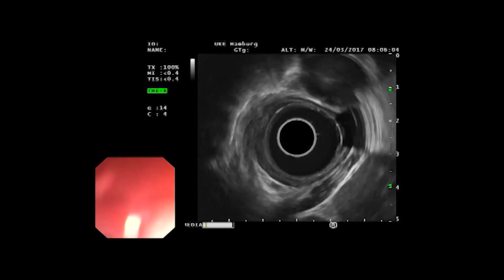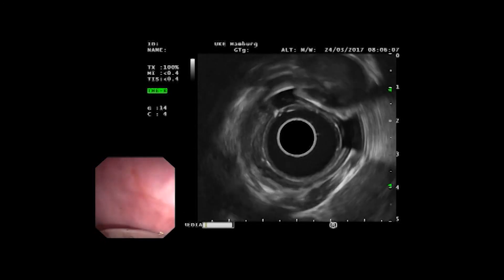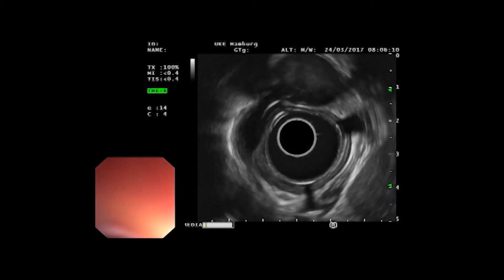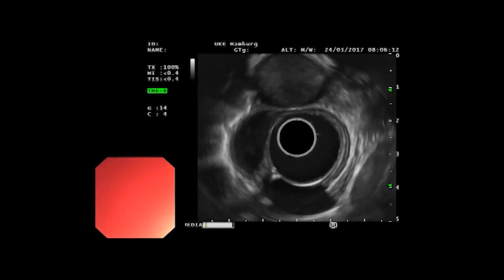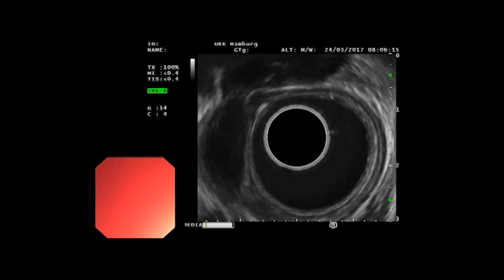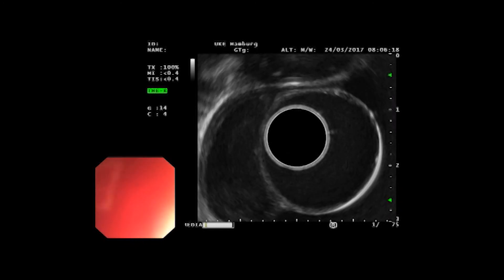It is only on closer examination that the tumor slowly comes into the picture, and the outer layer of the muscularis is seen to be separately preserved. In this detailed image, it is mainly a matter of what is called the transitional zone, i.e., the area from which the normal wall develops into the tumor.